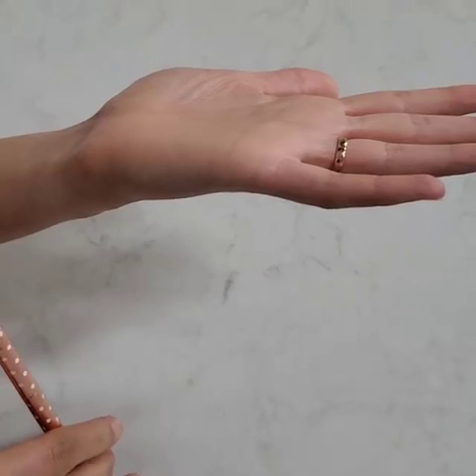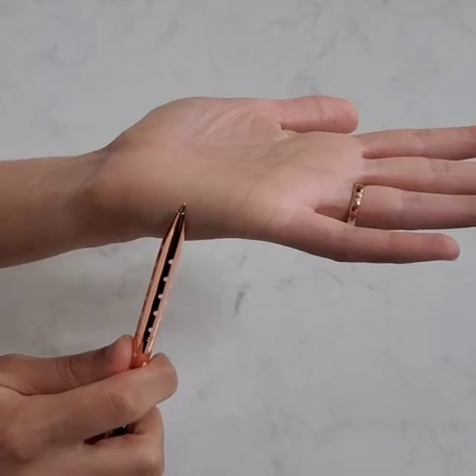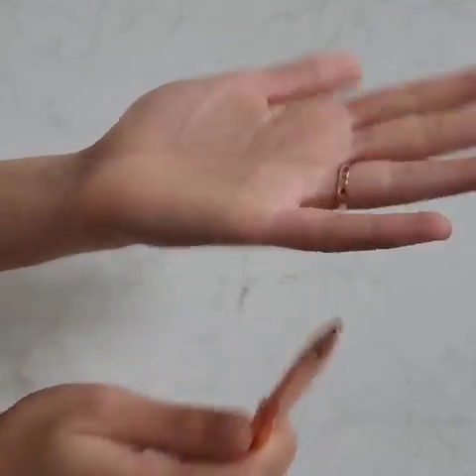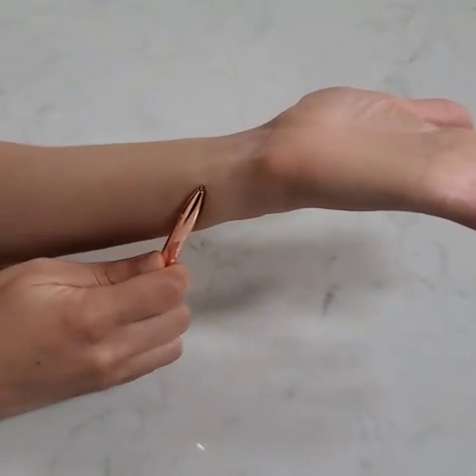Today we're going to talk about the ulnar motor nerve conduction study setup. Your active will be in the muscle belly over the abductor digiti minimi. Four centimeters away at least — bony landmark. Ground. Measure eight centimeters. That's your first stimulation site.